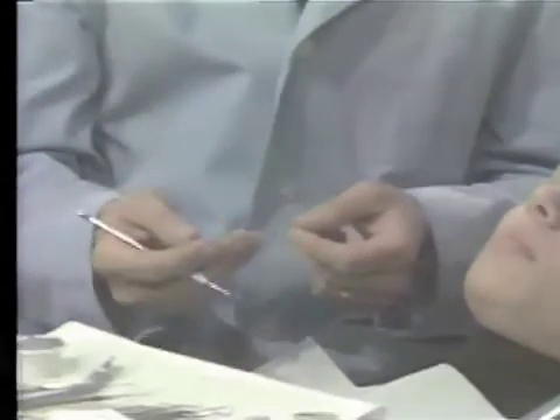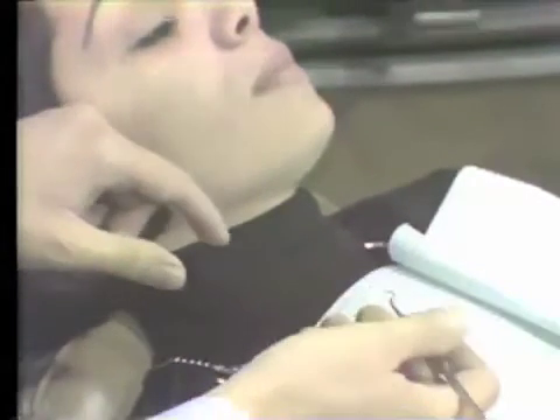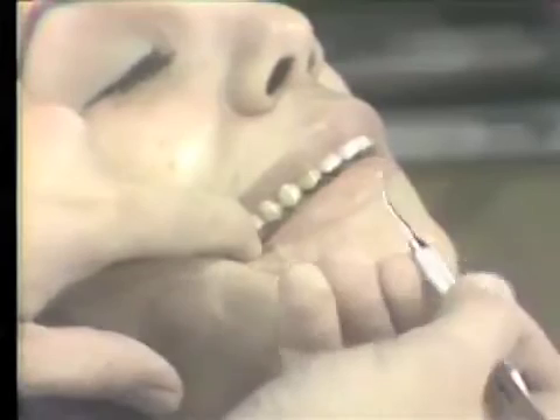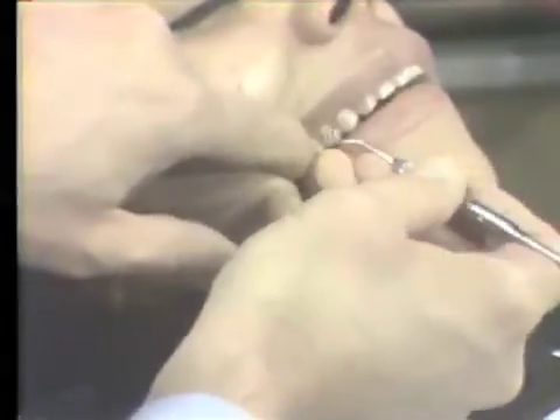When using instruments in the mouth, a fulcrum finger is always used. Generally, that fulcrum finger is the fourth finger of the right hand in right-handed individuals. The fulcrum finger may be placed on a finger which is used for cheek retraction such as this. When scaling, the fulcrum finger is placed on this finger and scaling is done in this manner.